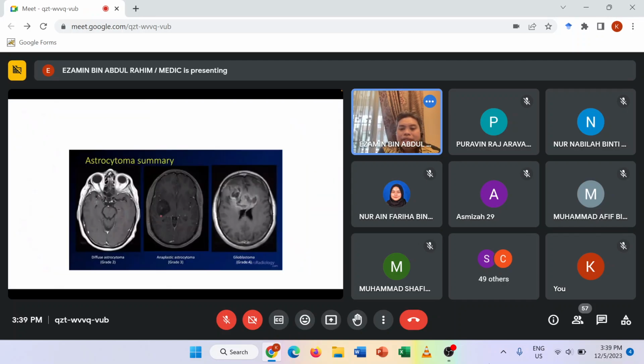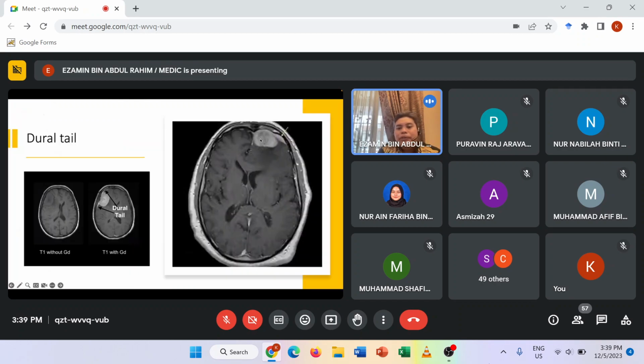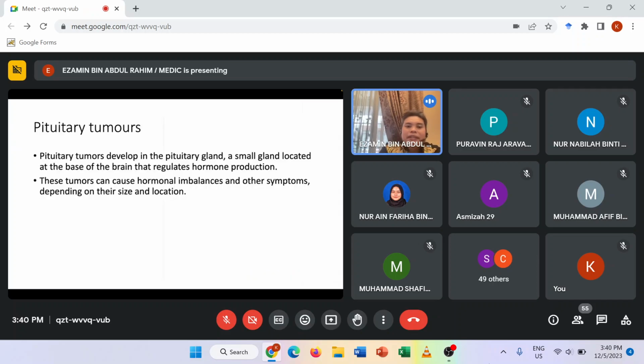So that's why, let's say this one, you see flow voids or a spiny appearance here and there, and then this one probably reach of this meningioma is atypical. Sometimes it is called hemangiopericytoma. That's a bit different. I think it's quite difficult. For you guys, I think just know that glioma, meningioma, those are the characteristic features.